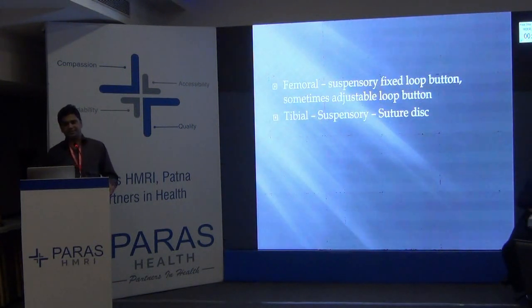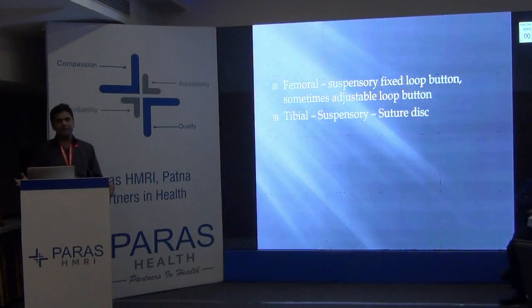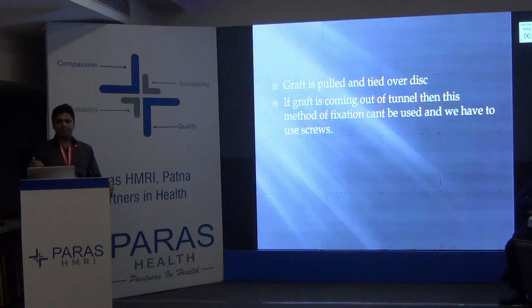So femoral suspensory fixed loop button, sometimes adjustable loop when I get a very long or very short tunnel. Tibial side is always suspensory suture disc. The graft is pulled and tied over a suture disc. If the graft is coming out of the tunnel and if it is long, then this method of fixation cannot be used and you have to use a screw.